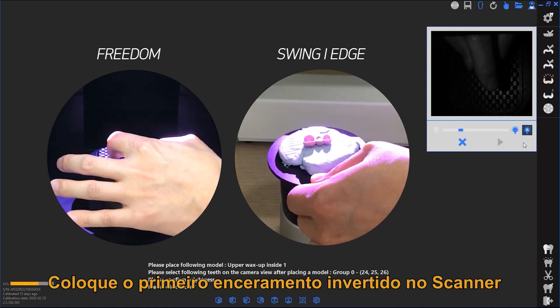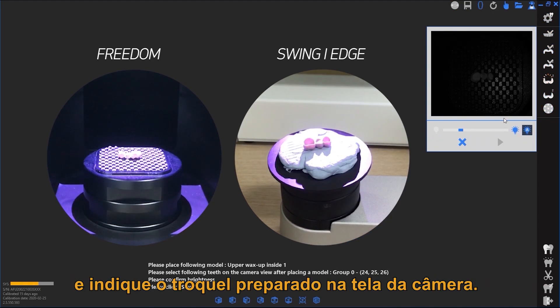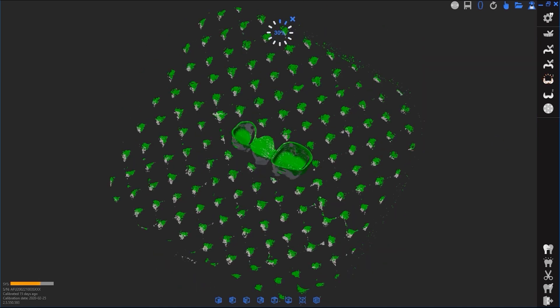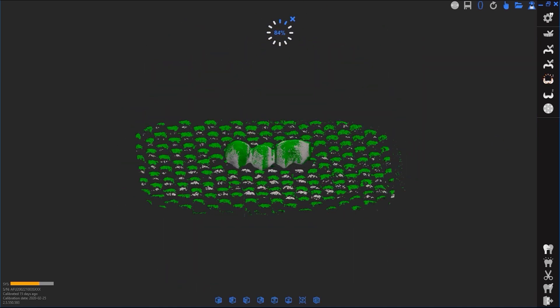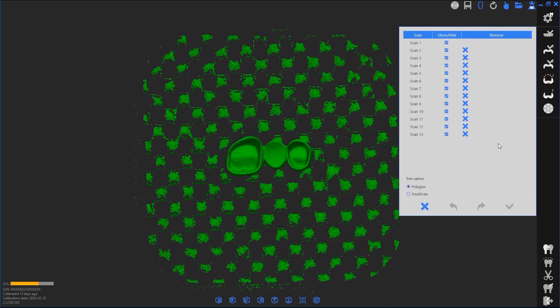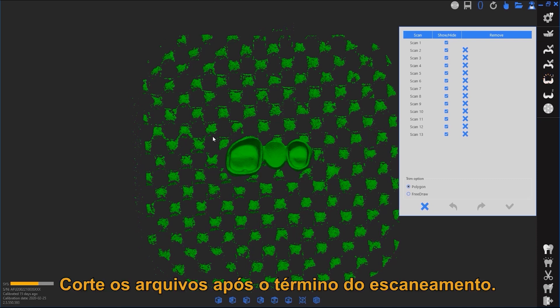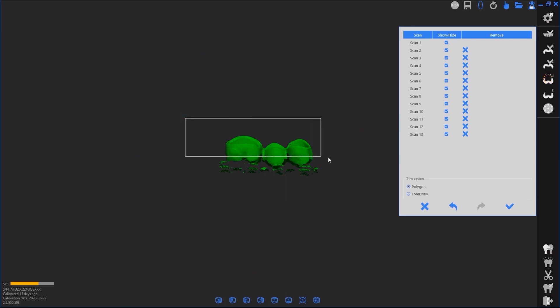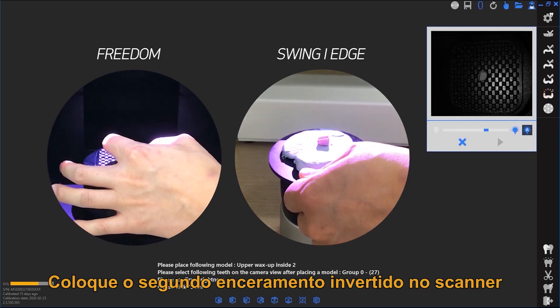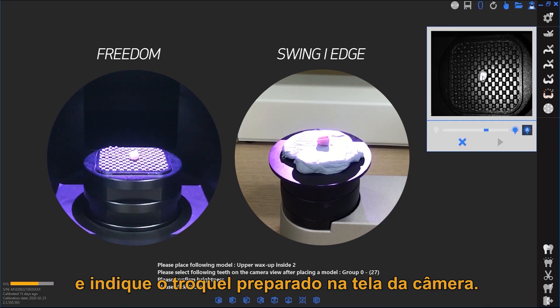Place the inverted first wax-up in the scanner and indicate the prepped die in the camera. Edit scan data once the scan is complete. Then place the second wax-up in the scanner and indicate the prepped die in the camera.